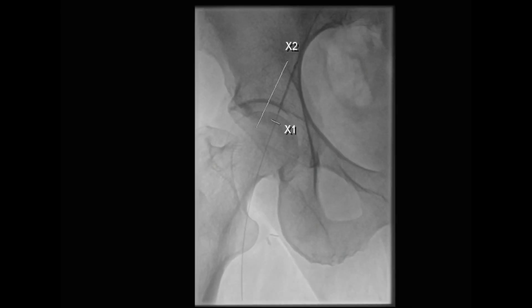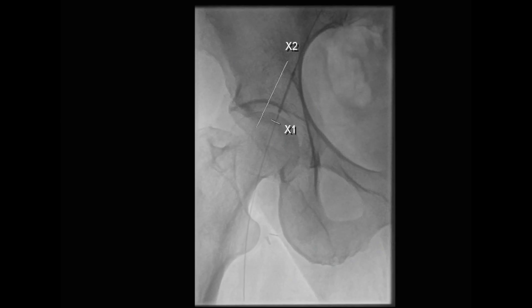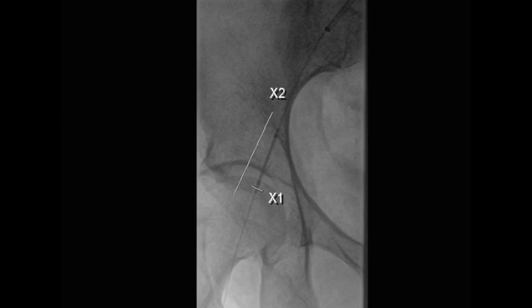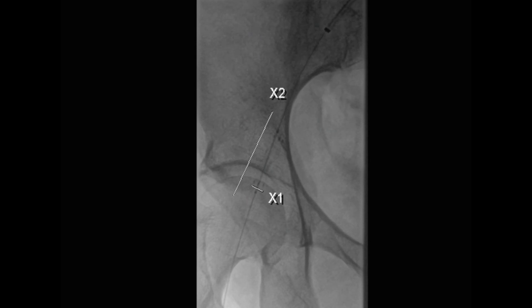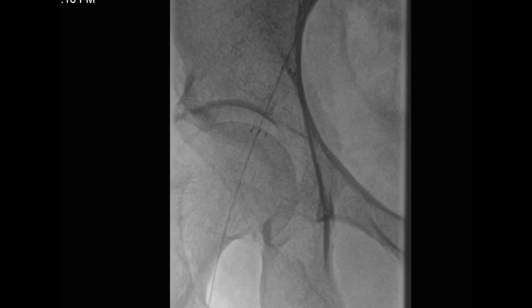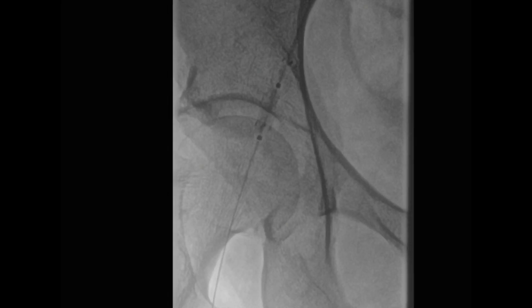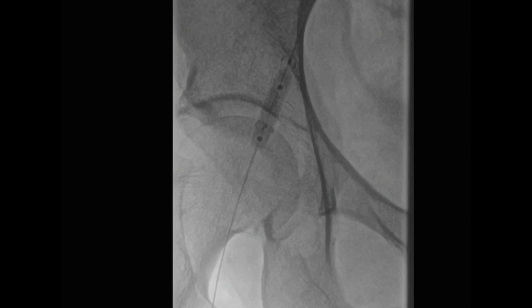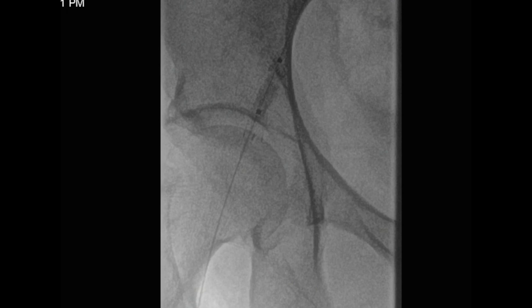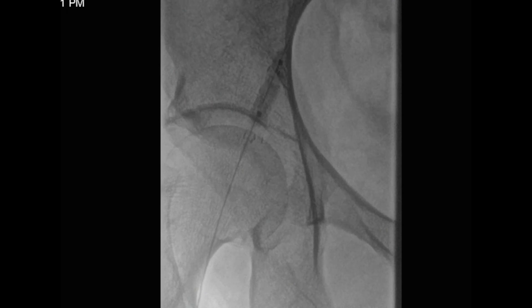We then brought in a 6 by 2.5 centimeter self-expanding Viabahn stent graft. This stenosis resulted from an external iliac artery dissection. The stent was then deployed as demonstrated here. We then brought in a 6 millimeter balloon and post-dilated this stent, resulting in good apposition of the stent graft to the wall of the artery.